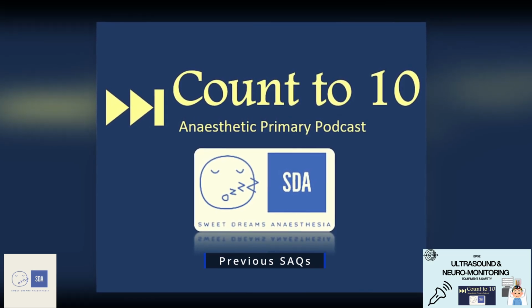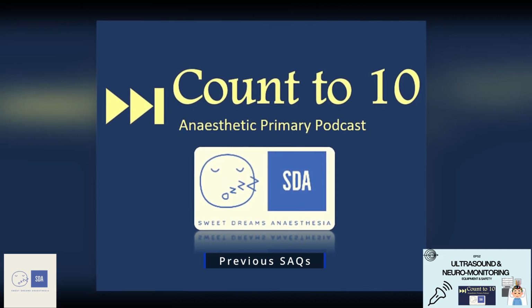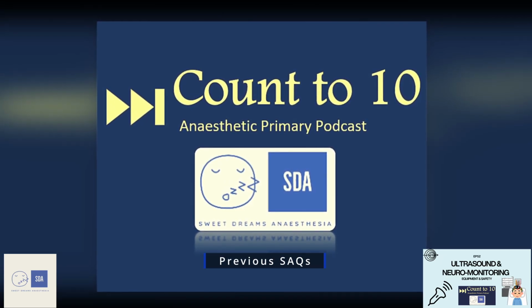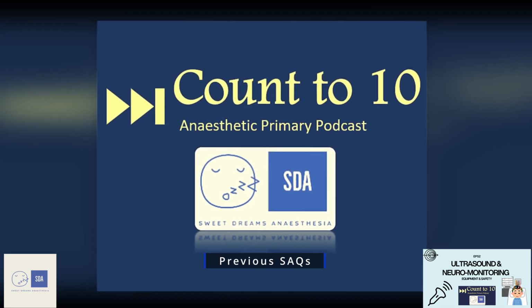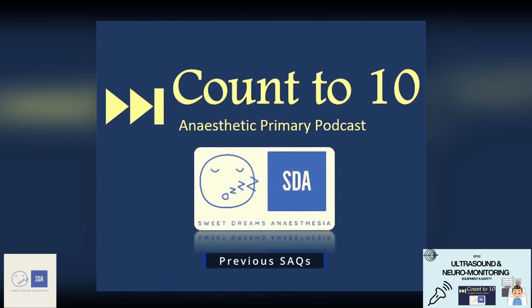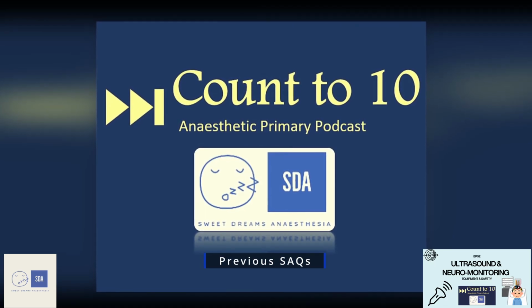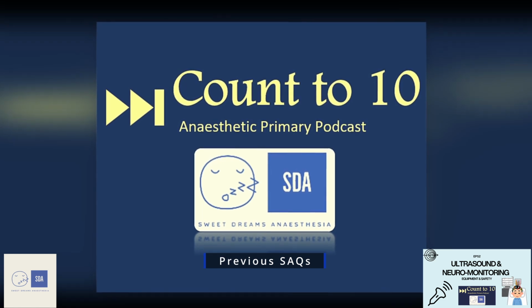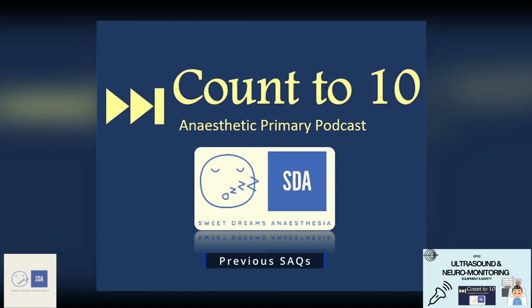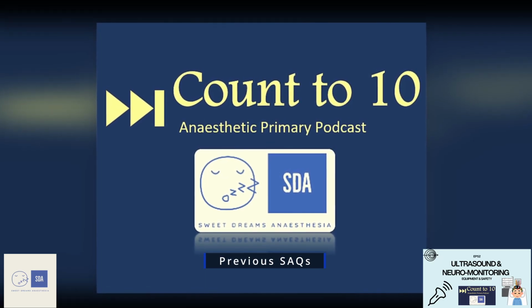With regards to the degree of reflection, this is mainly determined by the acoustic impedance of a substance. And here I would have the definition of acoustic impedance as equaling the density of an object and the speed of sound through that object. Then my next line would be, the degree of reflection is determined by the difference in acoustic impedance at the boundary of two different substances, aka tissues, where a larger difference leads to an increased amount of reflection.